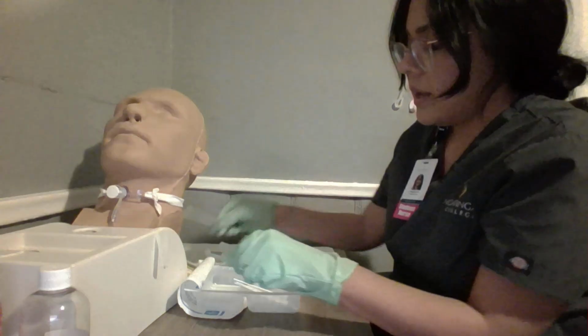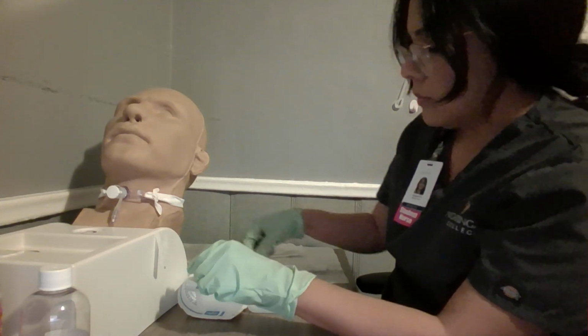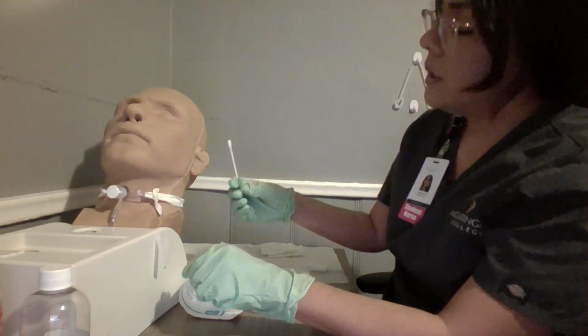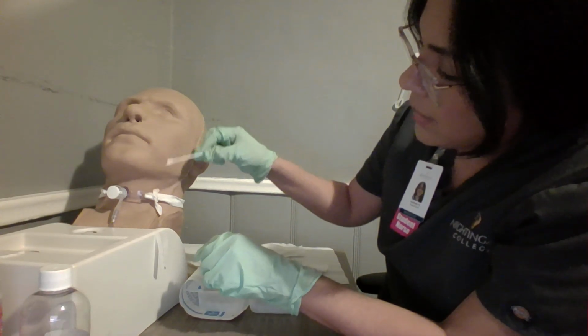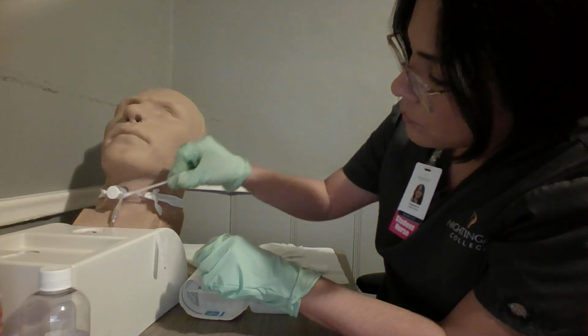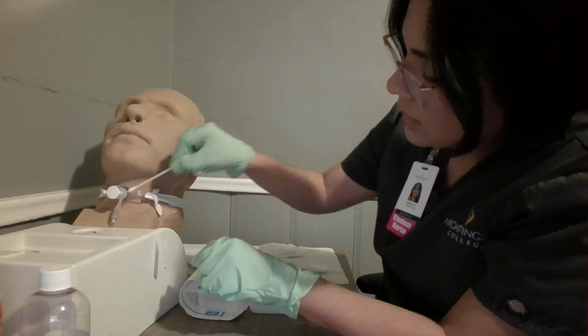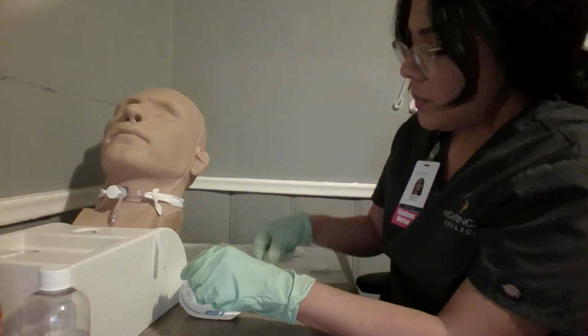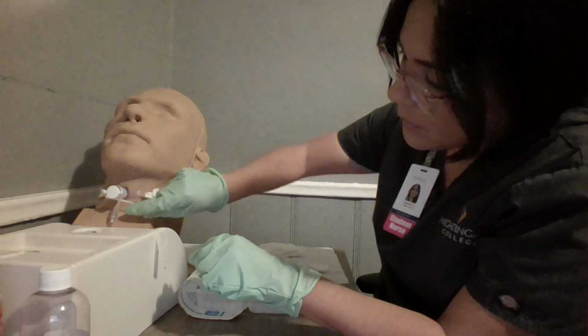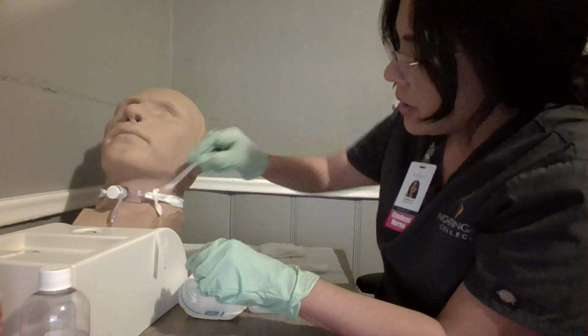I will discard that. I will take another sterile applicator, Q-tip, and then I will clean the face plate, and I will discard that. I will pick up another sterile applicator and I will clean around the trach, and I will discard that.